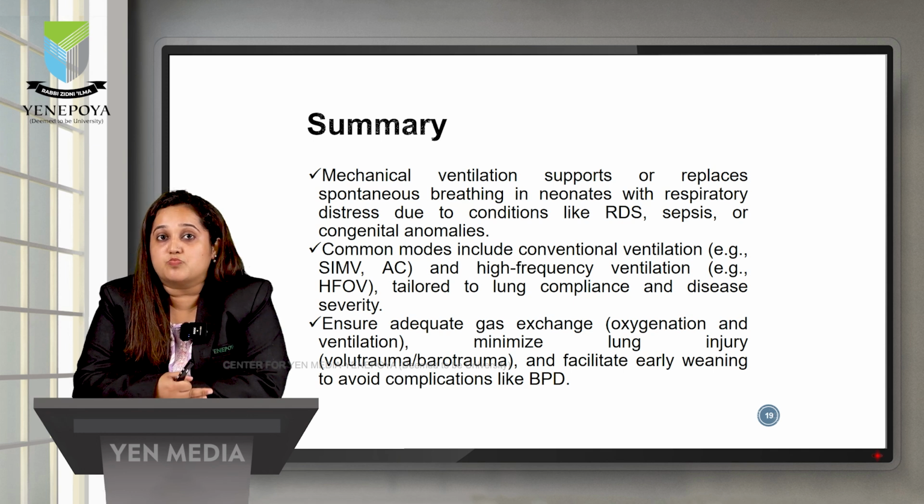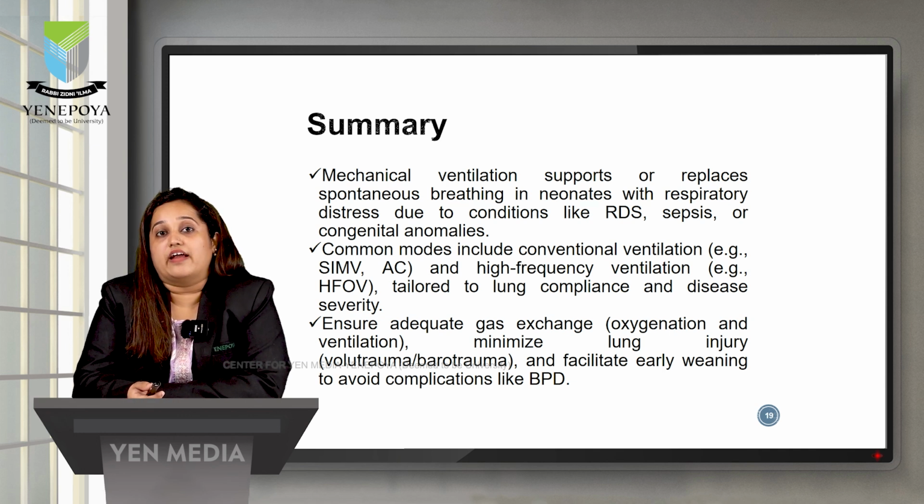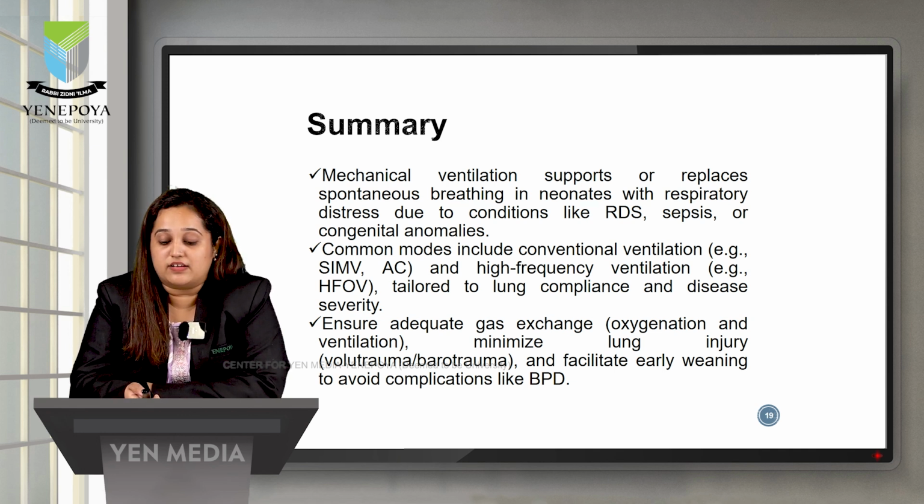And if the baby is responding well, start the weaning process immediately. If the baby is not responding well, always try to find out the cause, what is happening and how it can be corrected. By this you can end up actually ventilating the baby well.